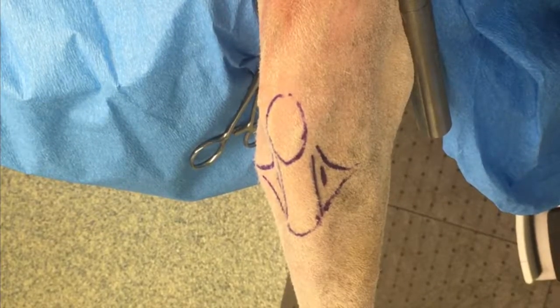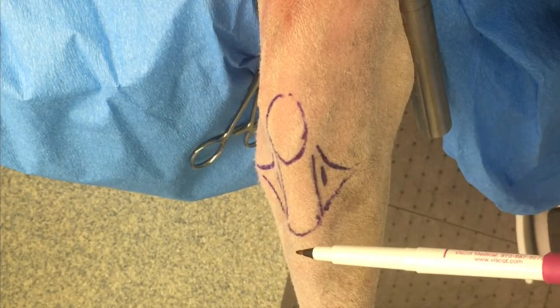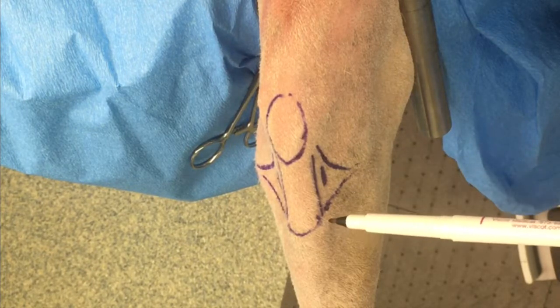For stifle arthroscopy, we want to identify the patella, the tibial tuberosity, the patella tendon between those structures, and the femoral and tibial condyles.